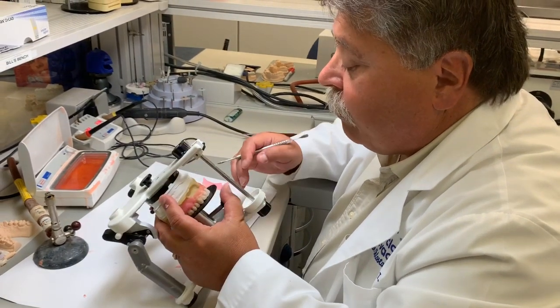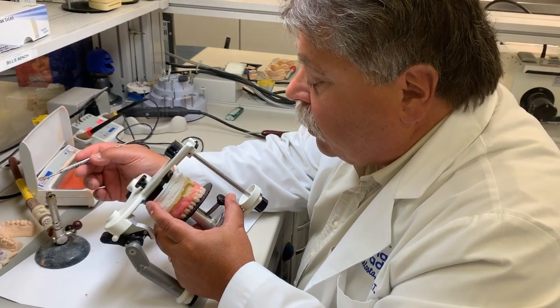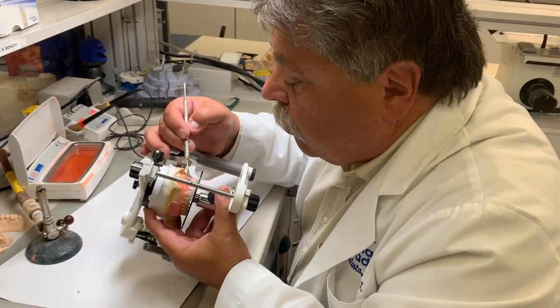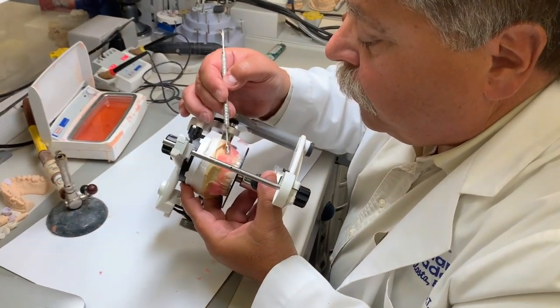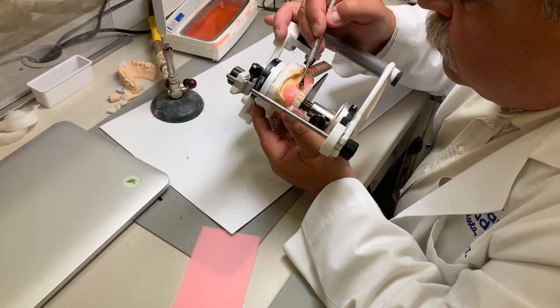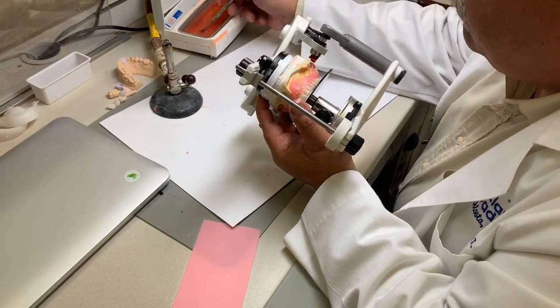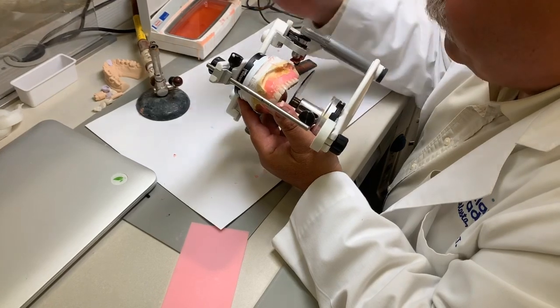And now that I have all the teeth set, what I will do is add a little bit of wax to make it look more like a natural denture. And then once this is done, it will go for a try-in, and the patient can approve or disapprove or make any changes that they need.